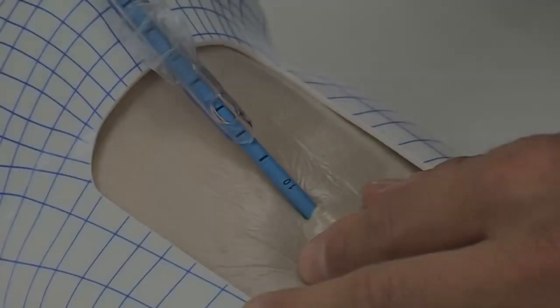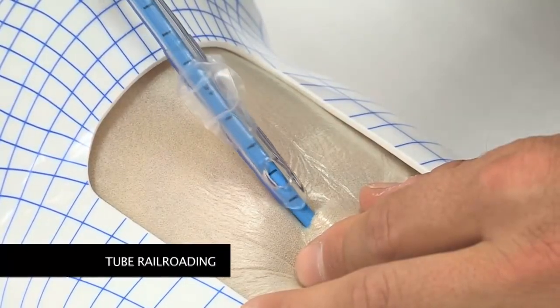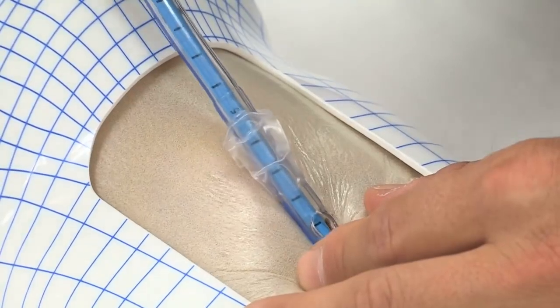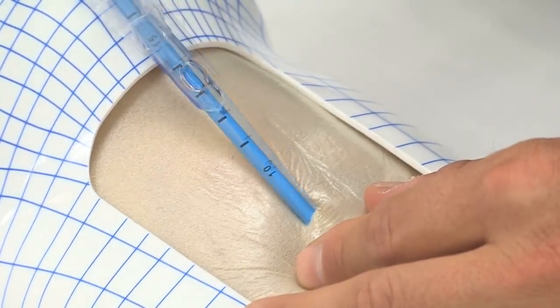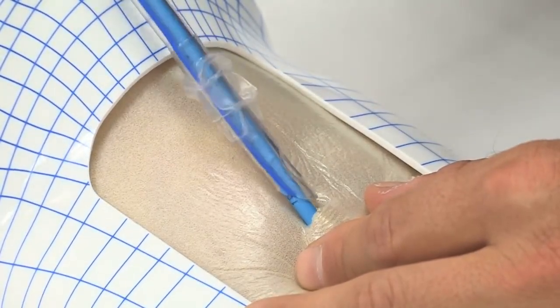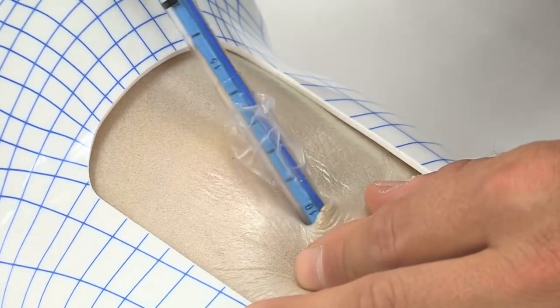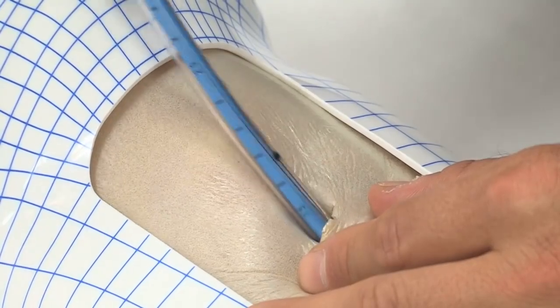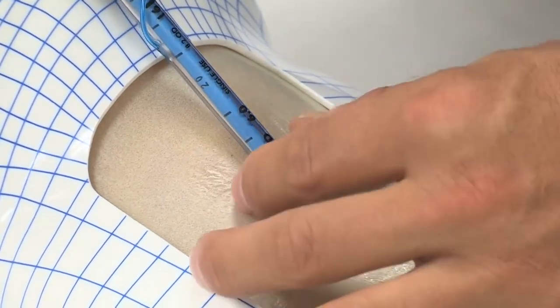Railroading a size 6 tube over the Scalpel Bougie can result in the tip of the tube catching on the skin and subcutaneous tissues. By beginning and continuing rotation of the tube prior to and during railroading, tube insertion can be performed smoothly and safely.